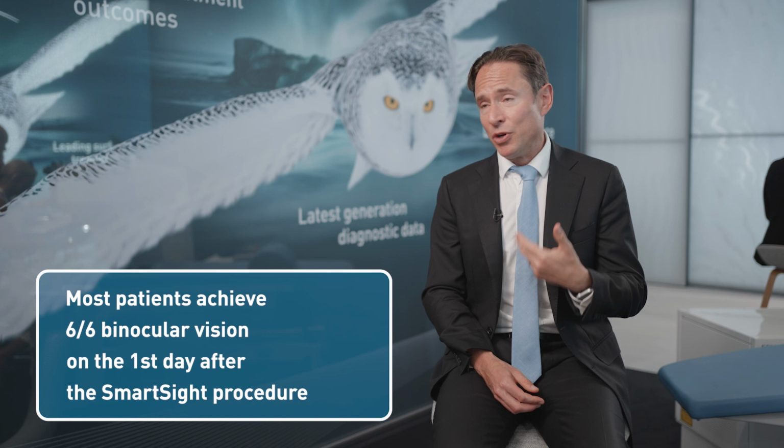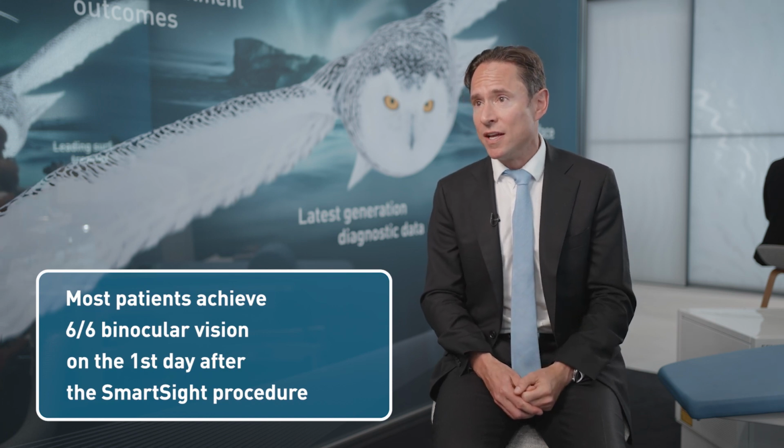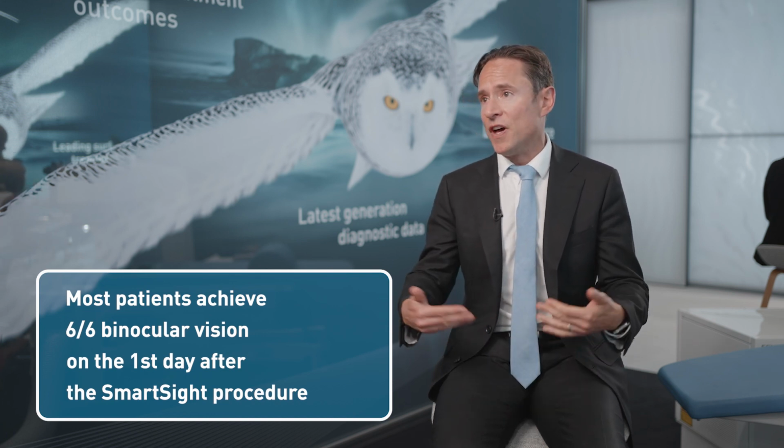So now we've got to the point where we've refined our surgical techniques. Energy parameters we're continuing to refine and improve. And we're seeing the vast majority of patients, binocularly, pretty much everyone is 6/6 or better on the first day. So we can reassure them that on the first day they can resume their activities. And I tell them that it will still get sharper within that first week. But by the time they come back at week 1, they're 6/5, 6/4, really identical visual outcome recoveries to what you'd expect with LASIK, maybe even a little bit better.